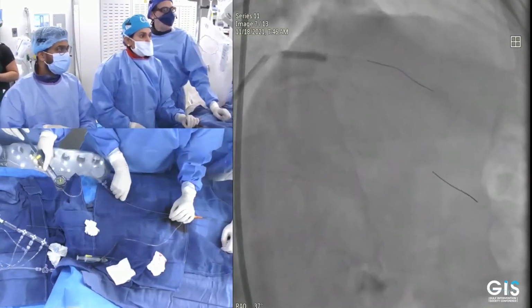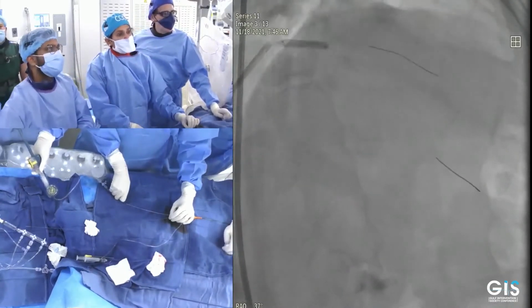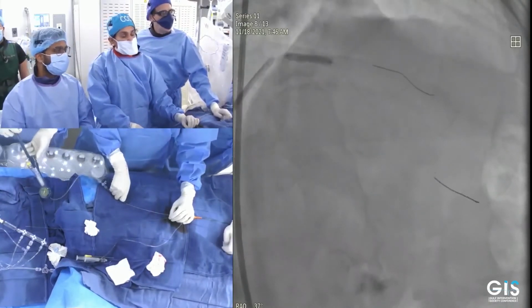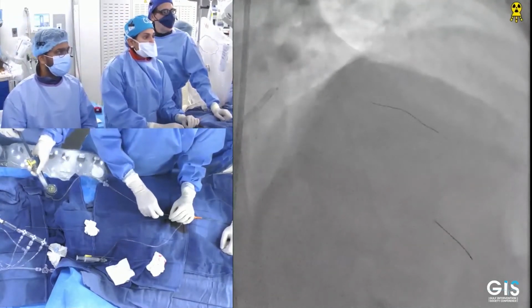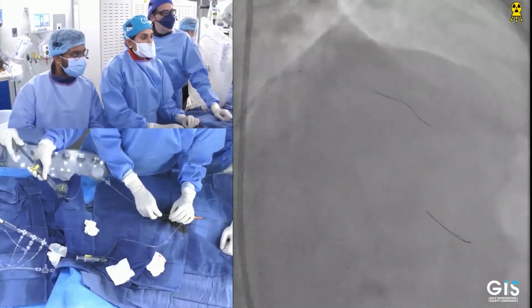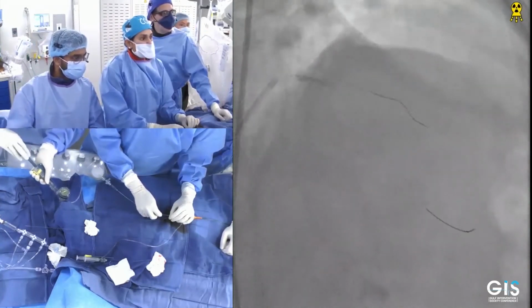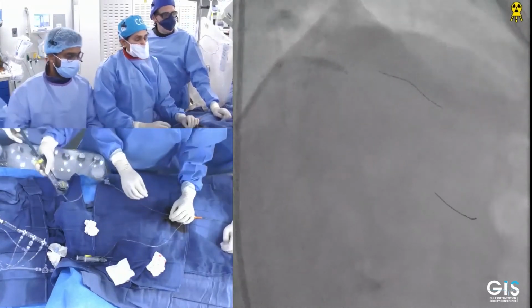We'll go very high pressure in the proximal LAD, 20 millimeter balloon at 20 atmospheres. And essentially, we're going to go a little bit across the diagonal, but not at 20 atmospheres. A little bit milder here. And then we decide, actually, after rotablator, whether to put a stent.